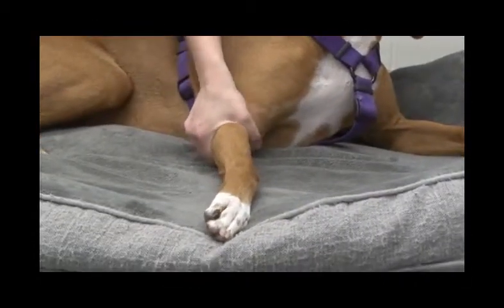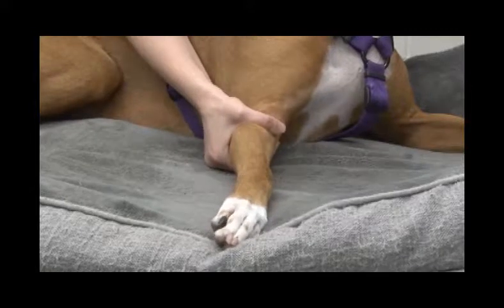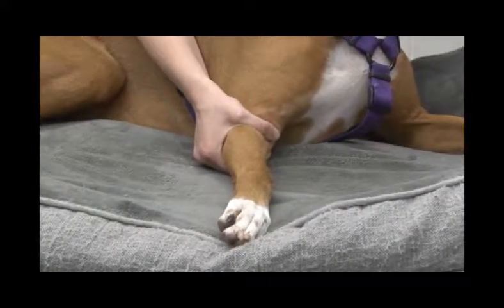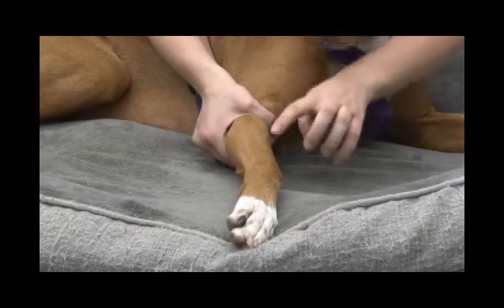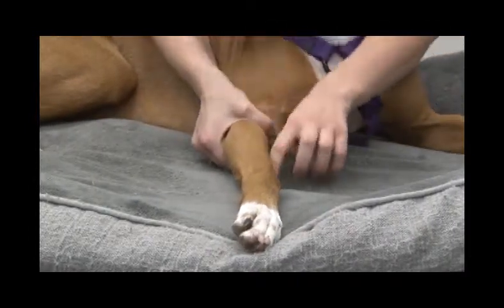You're going to push down a little bit and then roll your hand outwards, so your thumb is now on the front or cranial aspect of the leg. When you're pushing down to occlude the vessel, you can see her cephalic vein start to pop up right there.